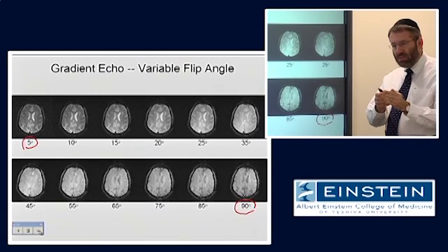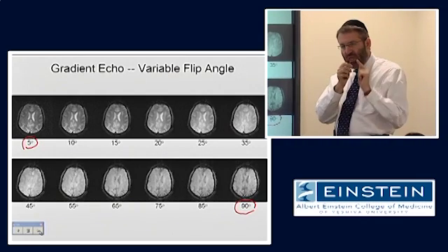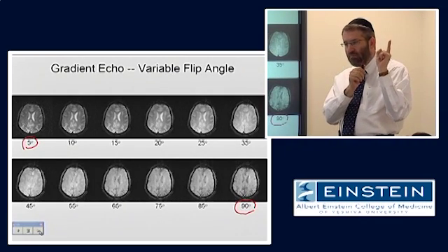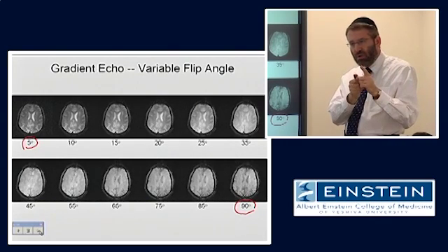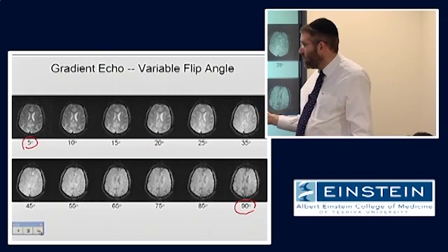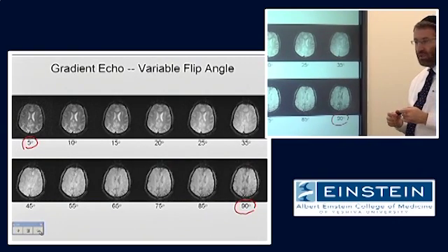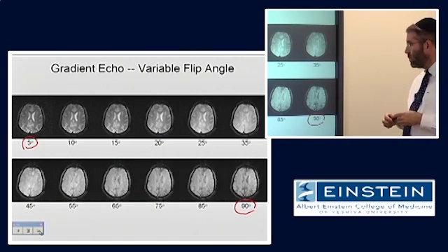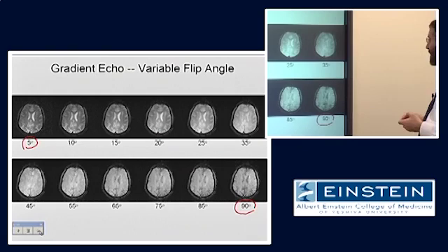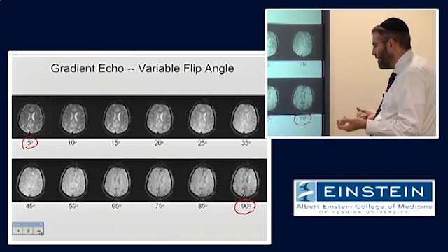Right? When we knock those spins down, it has to do with how much room they have to recover their longitudinal magnetization and differentiate themselves, so to speak, based on their different T1. Because that difference in longitudinal magnetization when we give the next RF pulse is what is going to determine whether we see contrast based on longitudinal relaxation, that is based on T1 in the image. One other thing here, if you look at these images, which are all shown at the same window and level setting, what's the Ernst angle? Anyone? How could you tell from looking at this?